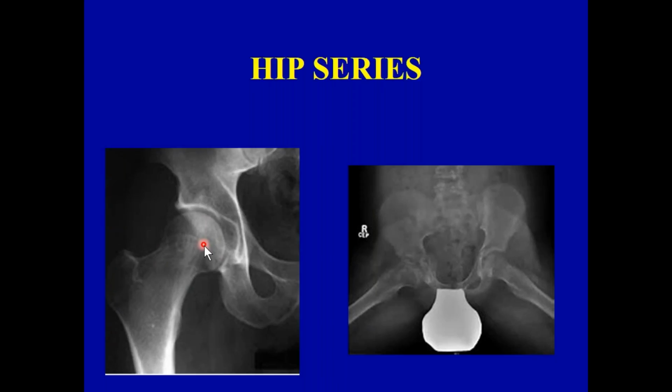We don't typically do this frog leg because a lot of us aren't set up with tables, so the patient simply lays on the table flat on their back, recumbent, and they try to get their heels together. Well, in most of our offices, we want to do one hip at a time. I'm showing you this because this is a good example of gonadal shielding, but patients can't do this without a table.